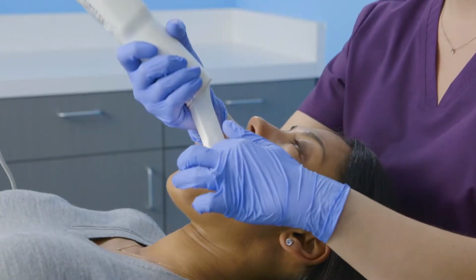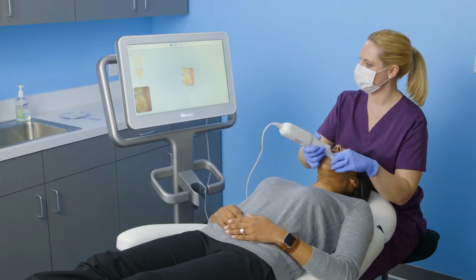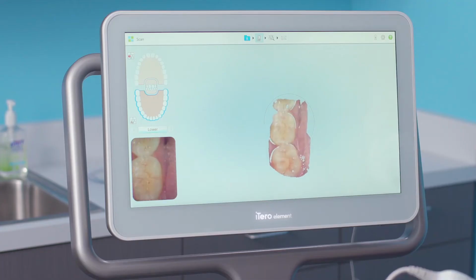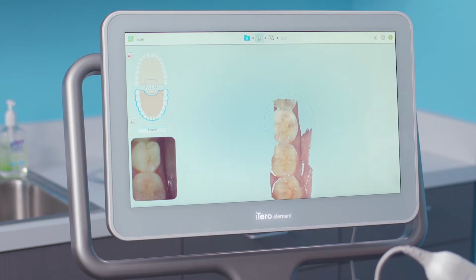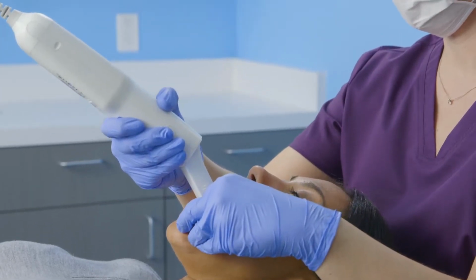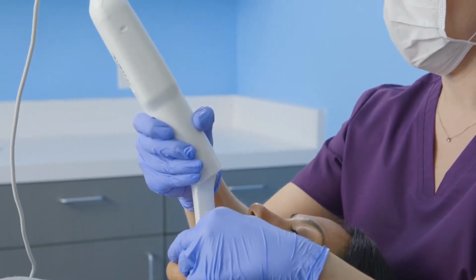Intraoral scanner is also called Intraoral Impression Instrument or IOS. It is no stranger to dentists. IOS is the foundation and beginning of oral digital diagnosis and treatment. But have you ever thought about the technical principle behind them and how to choose a suitable intraoral scanner?